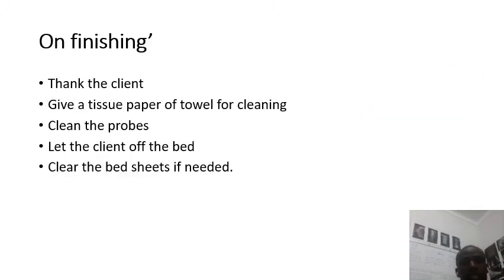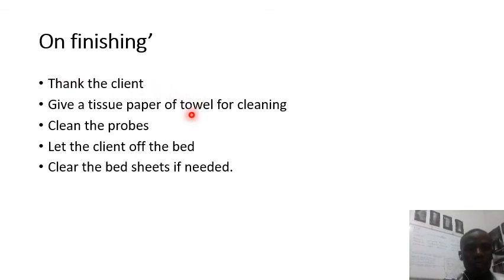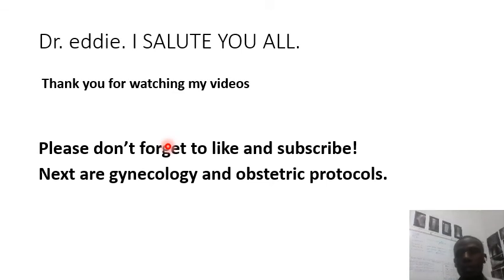Okay, so after all this, if you are dealing with a client and maybe there's a practical session, you have to thank the client, then clean the client, then clean the probes, let the client go off the bed, then you clear the bed sheets. Alright, so definitely you have to make a report after finishing any presentation or any practical ultrasound study. For the report, in case it is needed, you just text and I can email you how reports are made.